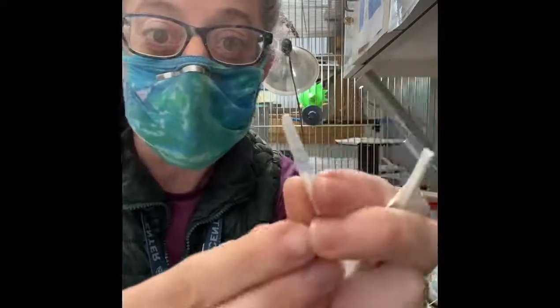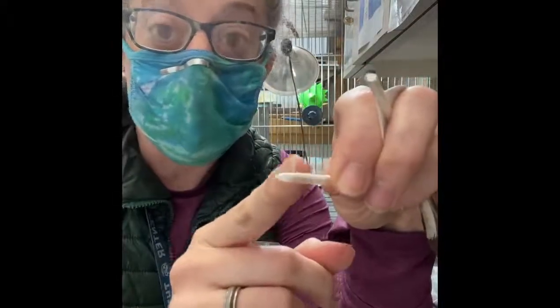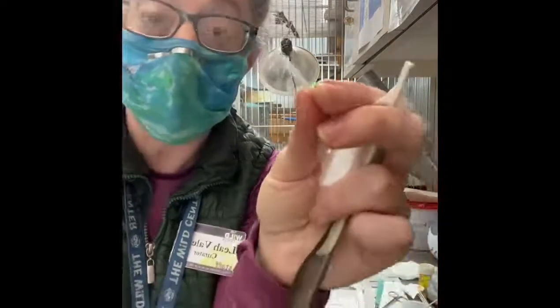It's kind of in the shape of a beak — a little hard to tell. So what we're going to do is cut the end of this and try gluing it onto the tip of Livia's beak, to see if we can get the tip of her beak a little more usable so she can eat a little better. So we're going to go ahead and try that.